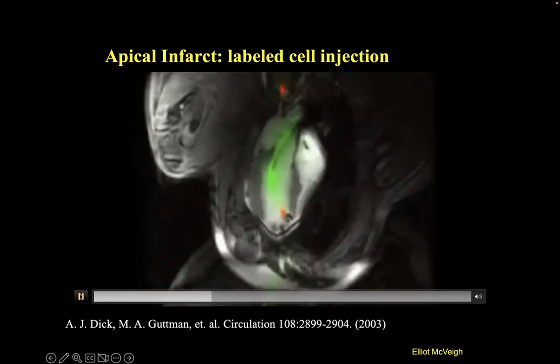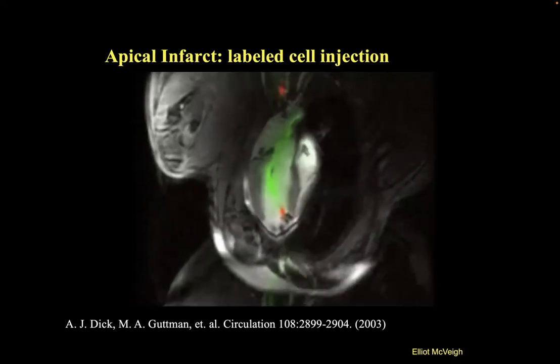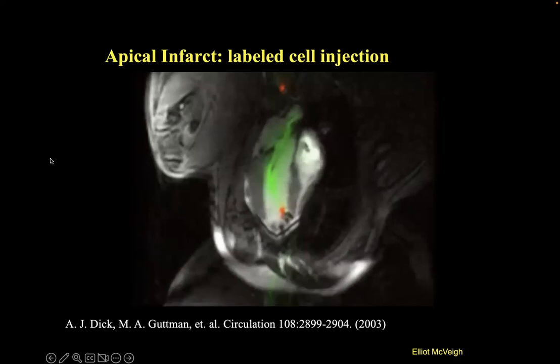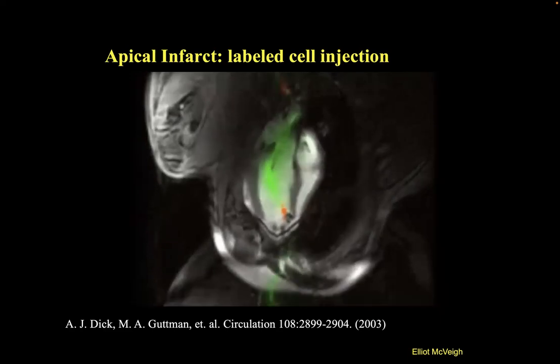So this was real-time image-guided interventions with MR in the heart. It's hard to do, because getting images at 7 frames a second is not easy from an MR scanner. You need a special set of gradients and a lot of juice.